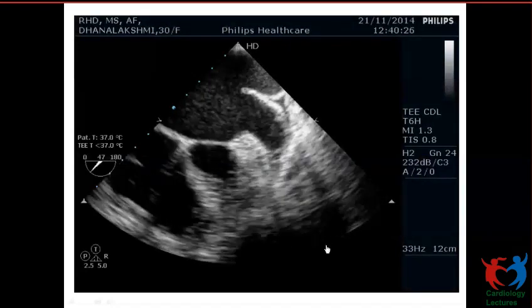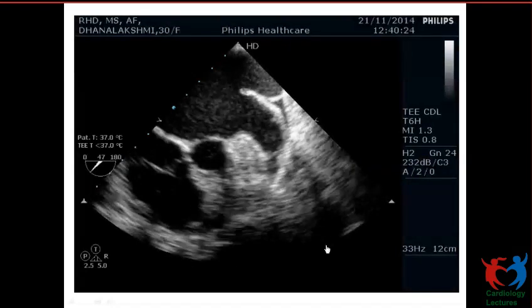Trying to show a four-chamber mid-esophageal view, showing LA appendage, pulmonary vein, and LV, RA and RV, showing a small LV cavity, but the LA appendage is there. Concentrate on the appendage, LA appendage. This is the left upper pulmonary vein joining there.